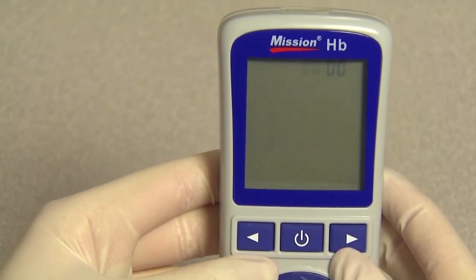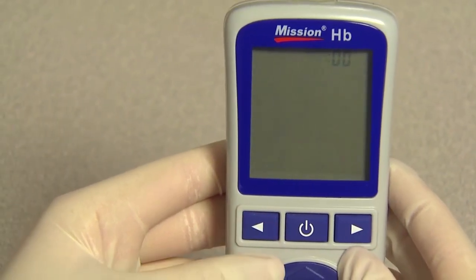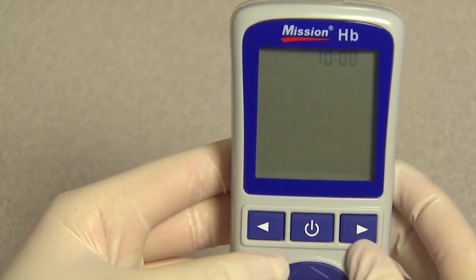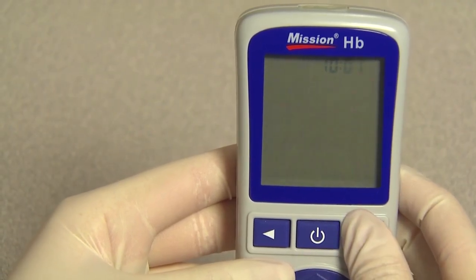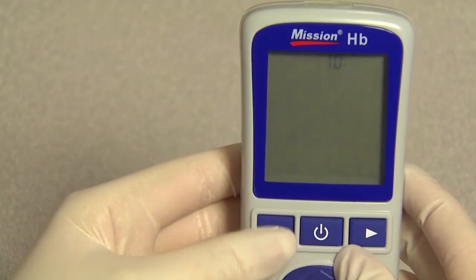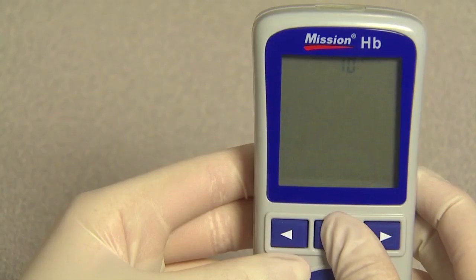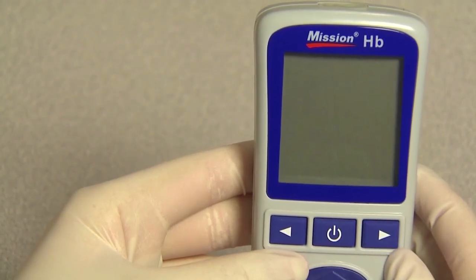Press right or left to choose the correct hour. Press the power button to save and then proceed to choose the correct minutes. Press the power button to save the setting. After that, the meter turns off automatically.